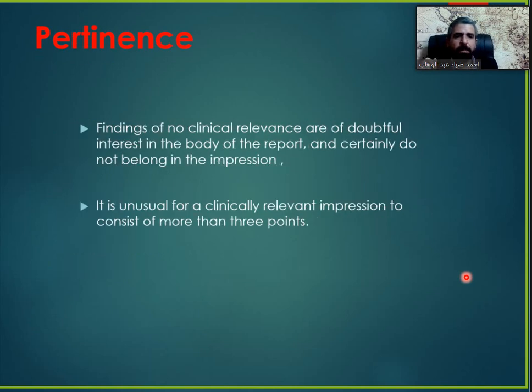Now, let's talk about the pertinence. What do we mean by pertinence? Pertinence is importance. Findings of no clinical relevance or doubtful interest to the body of the report, don't write them, or write them at the end. Okay? They do not belong in the impression. Don't write them in the impression. It is unusual for a clinically relevant impression to consist of more than 3 points. Impression should have not more than 3 points.